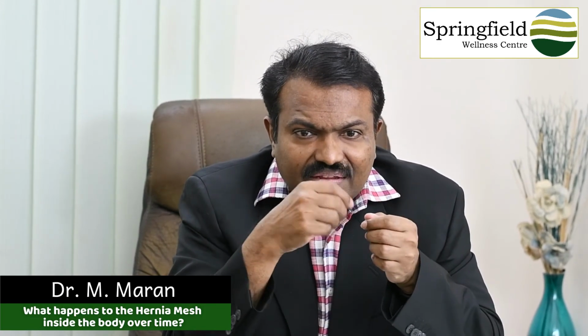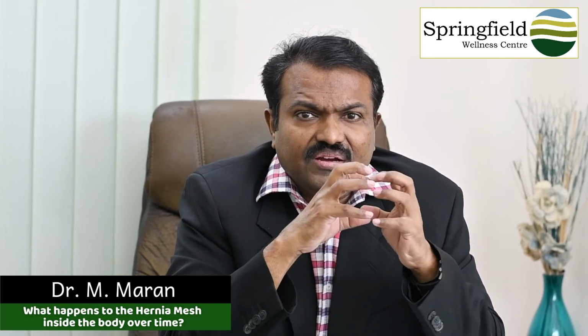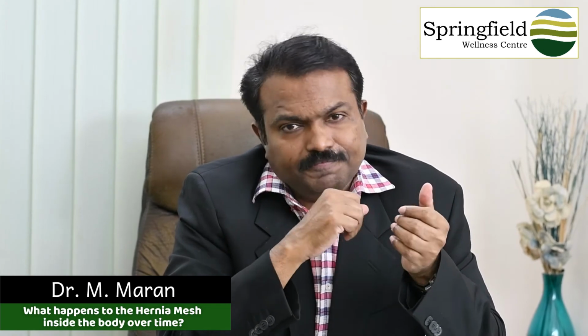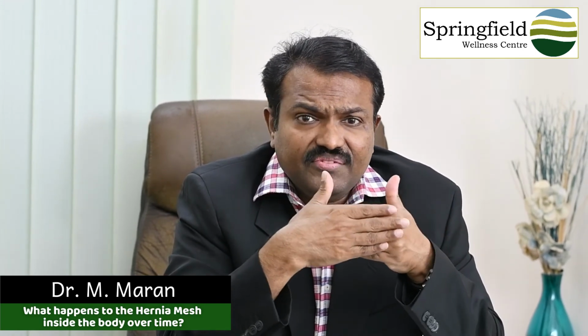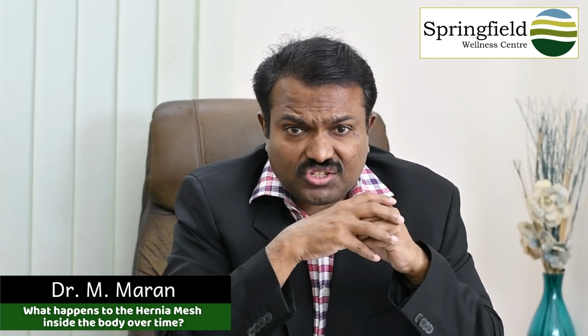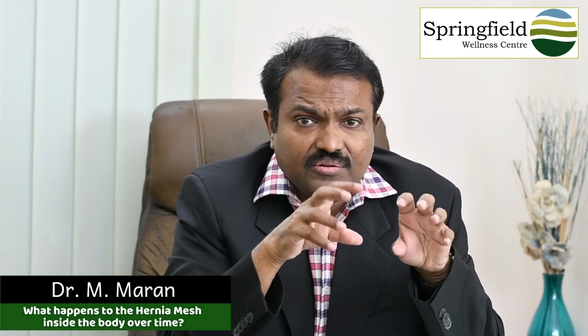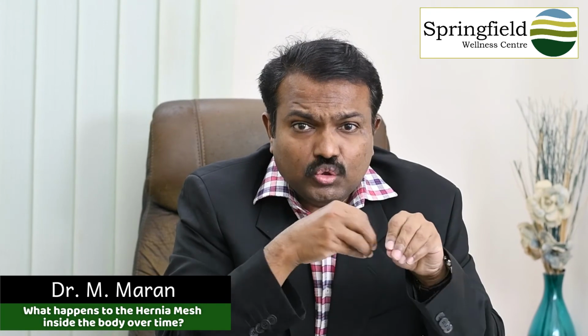Another thing is that a synthetic mesh, if it touches the intestine, colon or any other structure, can irritate and cause adhesions, where structures get adherent and cause a lot of trouble and pain. If the irritation is too high, it can even cause perforation, holes in the intestine or the structure, and the holes can get infected or cause a fistula between two structures.